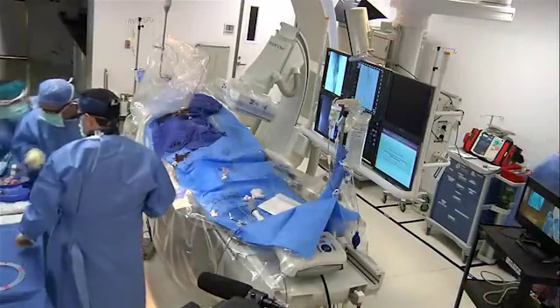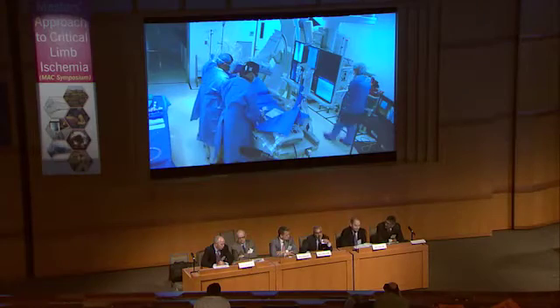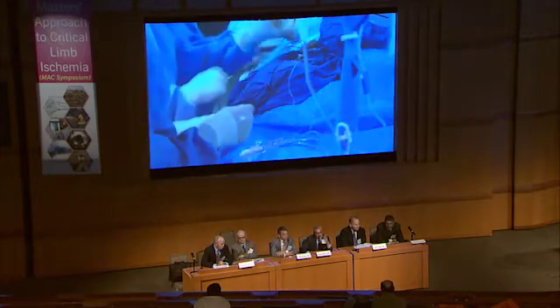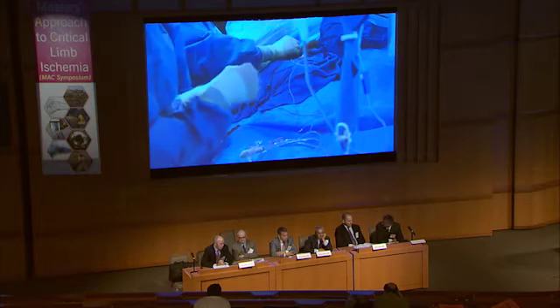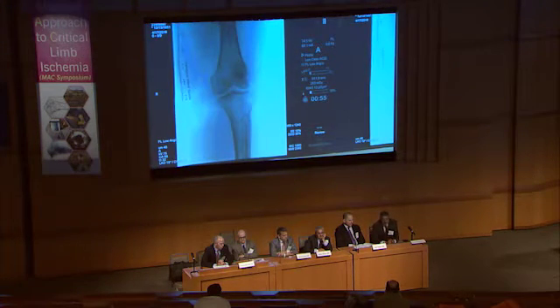Go ahead. Would it be possible to remove the wire from the balloon and inject through the balloon, with the balloon inflated, to see if there are other fistulas in the below the knee area? I'm going to get a selected picture here next to the wire we have in the SFA. I think it's worth it. I think this case is interesting. It's not so much the intervention, but rather these fistulas and dealing with this. And we have all you guys there, which makes it wonderful.